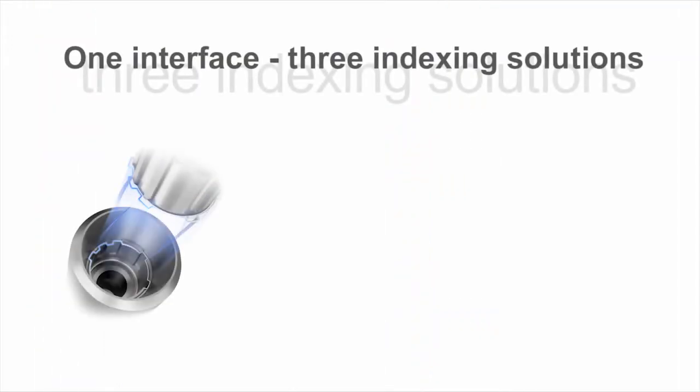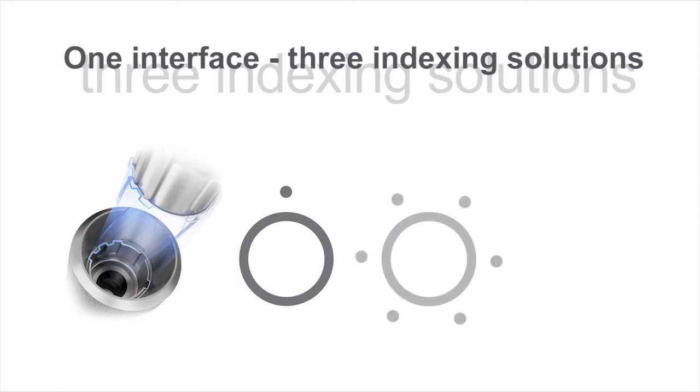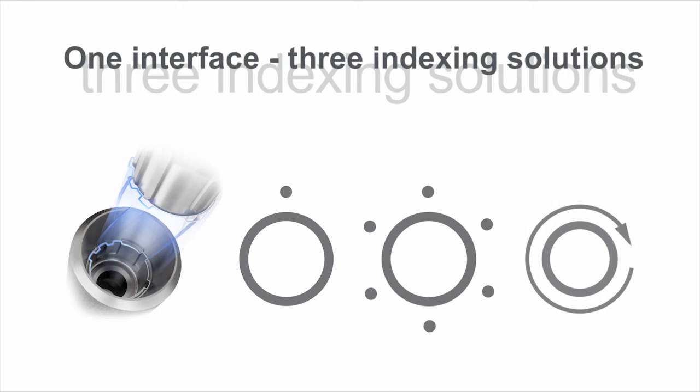One interface, three indexing solutions. In addition to the one-position-only placement, the interface design also allows for flexible six-position indexing of prefabricated abutments, while index-free abutments can be seated in any position.